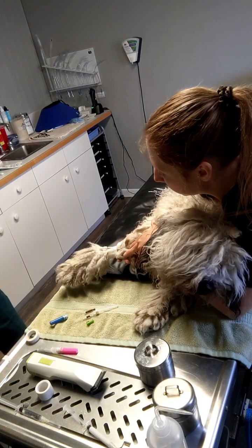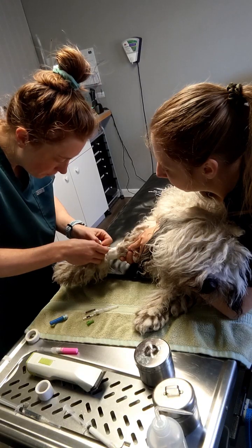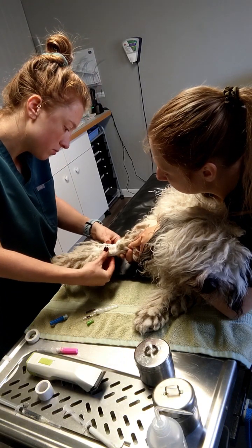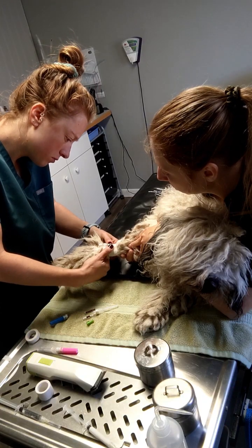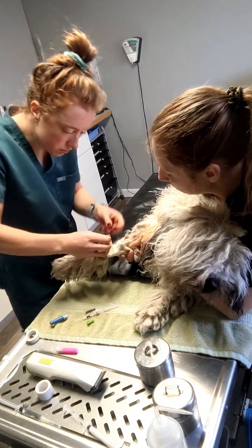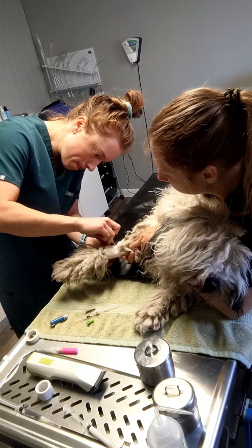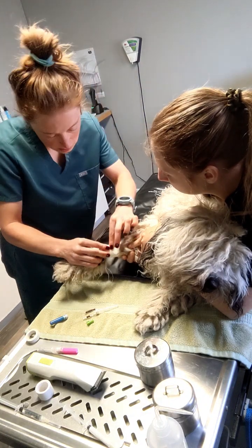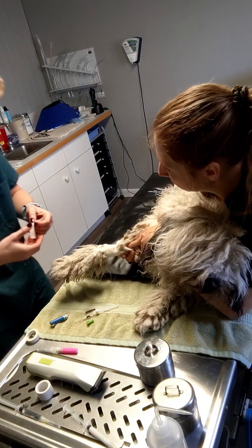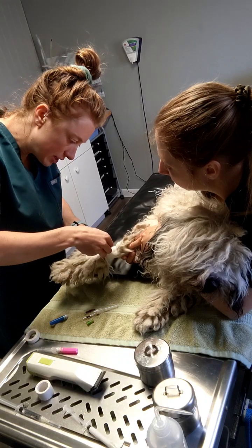And then I'll add the other following pieces of tape to make sure it's secure. Over the port, right? And the last piece of tape, I'm going to do kind of an X pattern just to make sure that the port is nice and secure.